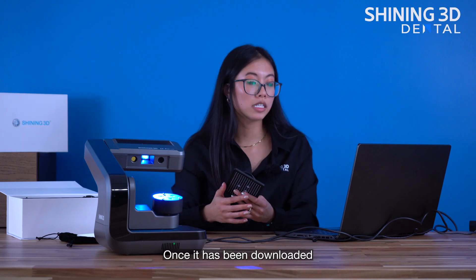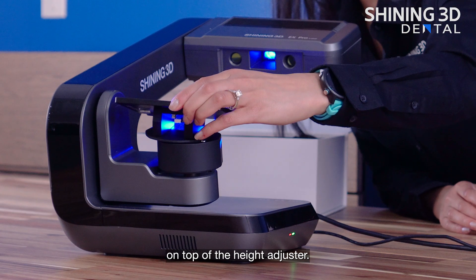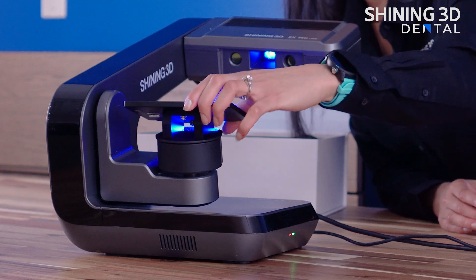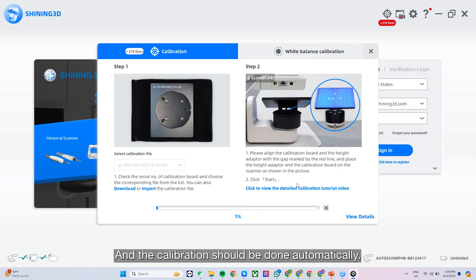Once it has been downloaded successfully, you'll place the calibration plate on top of the height adjuster. Let's click start, and the calibration should be done automatically.